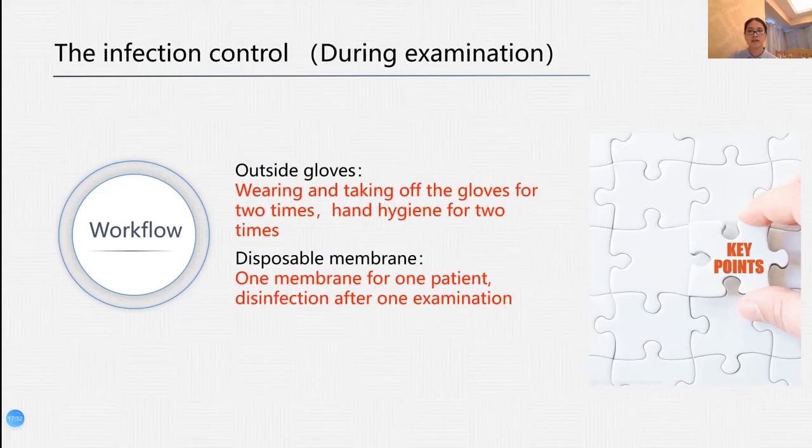And I think the key points are two. The first one is wearing and taking off the gloves 2 times and hand hygiene 2 times. The second one is 1 membrane for 1 patient and 1 disinfection after 1 examination.